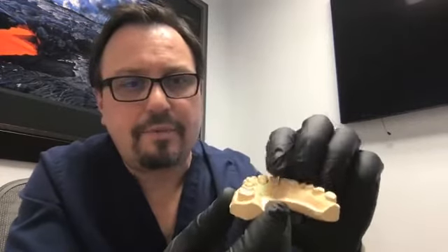So in this case, the veneers are all, probably more than 3/4 of the surfaces are enamel that the veneers will be bonded to. Even these palatal areas that I showed where we added veneer for guidance, even that's prepped such that it's still going to be largely on enamel there. And so that'll be bonded in on Wednesday.